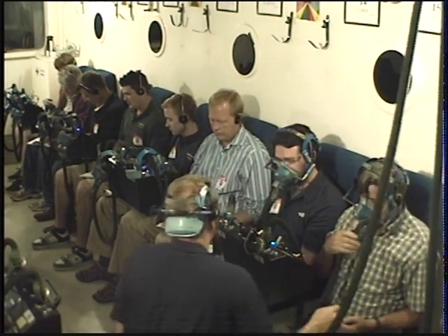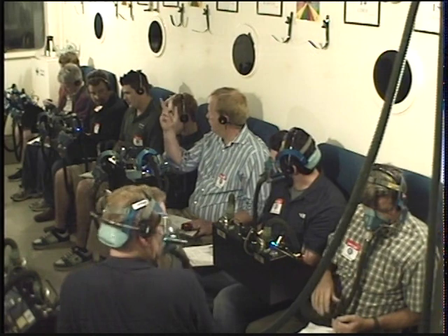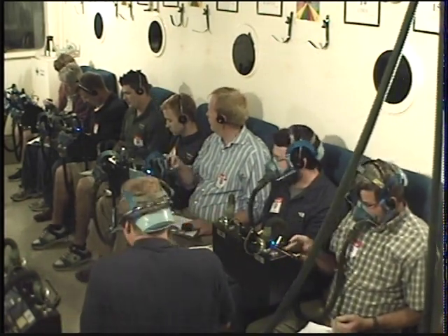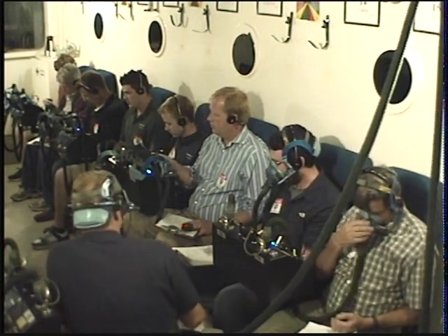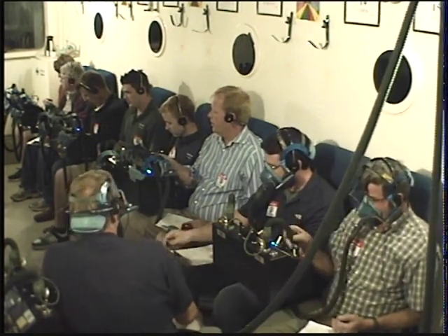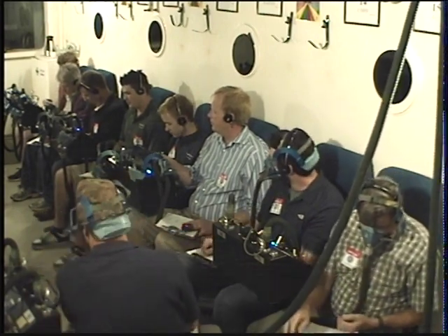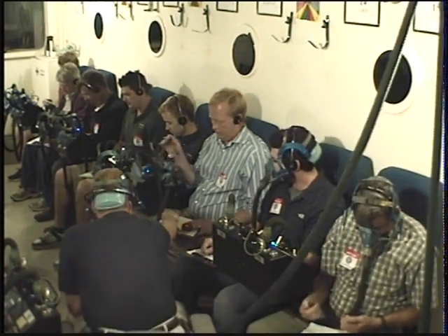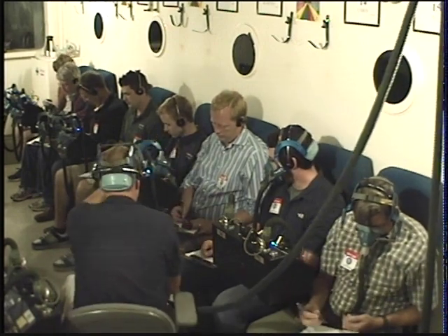All right. Let's go to Karsten. Karsten, how are you doing? You doing A-okay? You have 2 symptoms? Hey, Karsten, do me a favor. Out loud so Eric can hear, I want you to count backwards from 100 by 3s. I'll even start you off. 100, 97. Karsten, that last number you just said, I want you to write down on your worksheet, and I want you to circle the number. Let me know, or let Eric know when you've accomplished that.